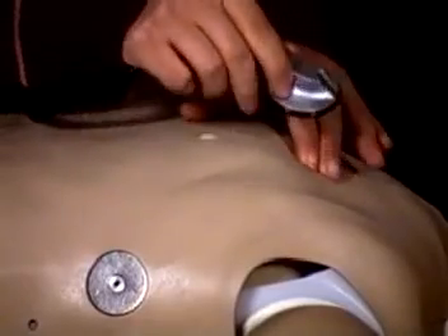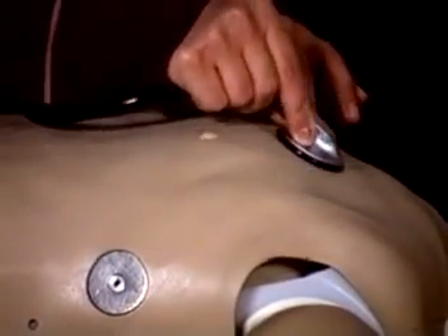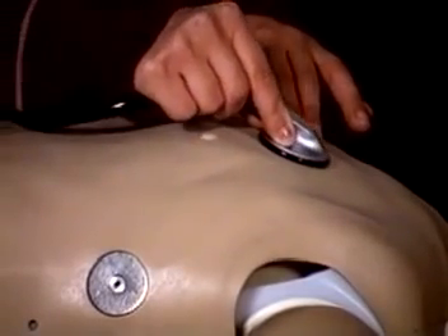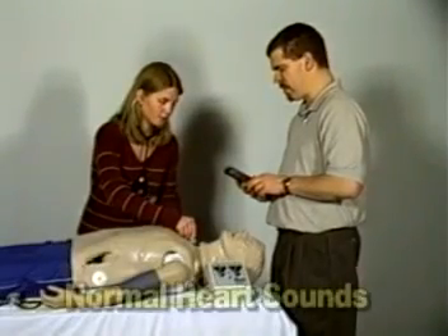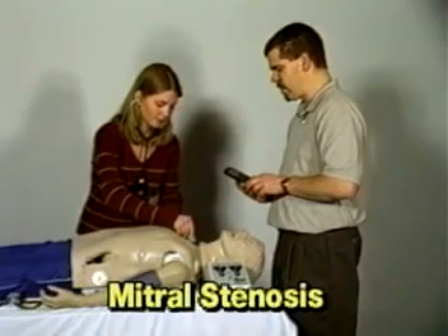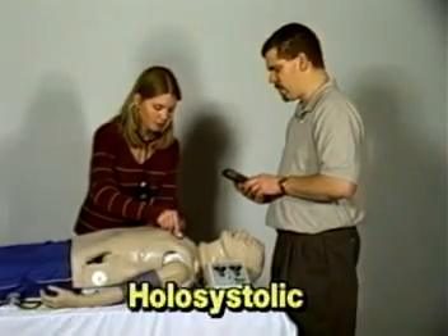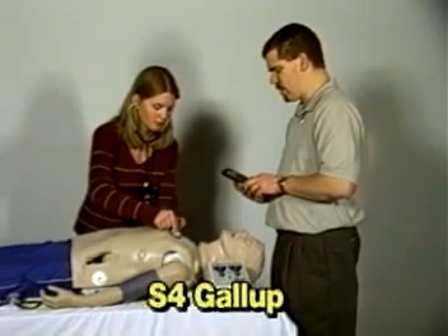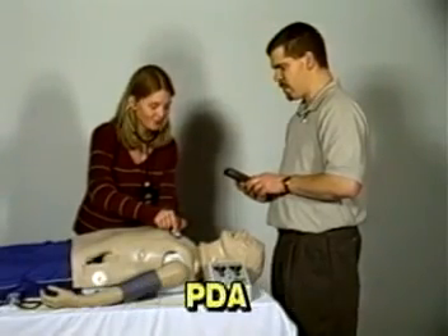The students must palpate to identify the correct auscultation locations, and will hear different heart or lung sounds as the smart scope is moved to different locations on the mannequin. Heart conditions covered include normal heart sounds, aortic regurgitation, mitral stenosis, pulmonary stenosis, holosystolic, mid-systolic, S3 gallop, S4 gallop, systolic click, atrial septal defect, PDA, and VSD.